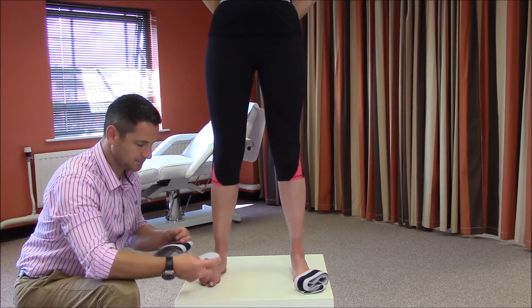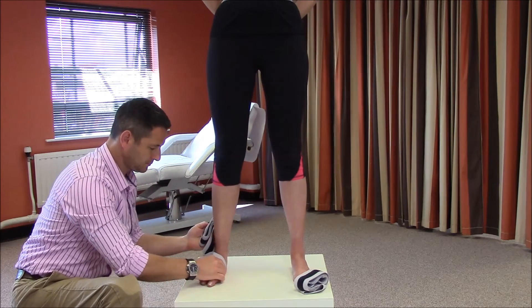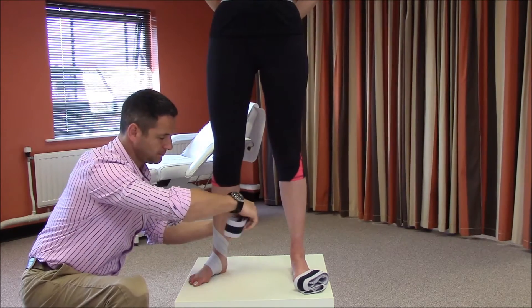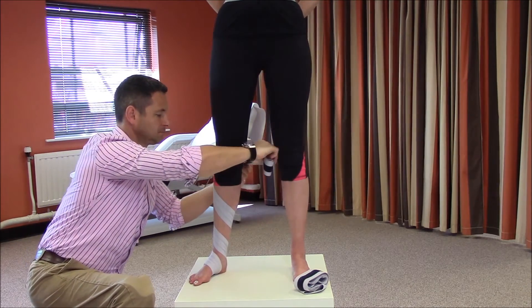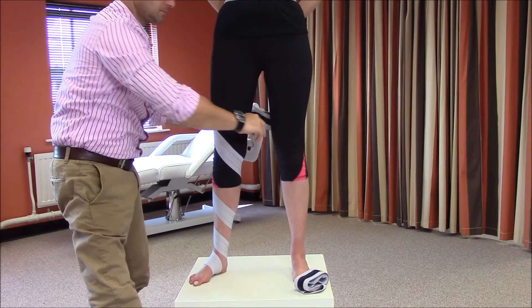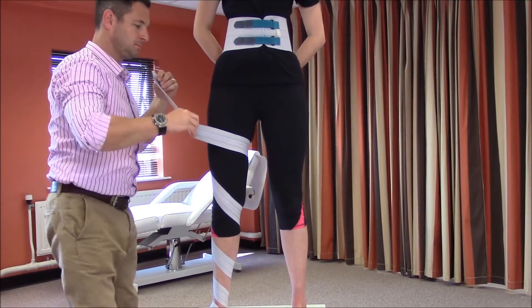Place the foot in the stirrup and wrap laterally over the instep and around the ankle. The garment should complete approximately four rotations of the lower leg and fasten to the contralateral side onto the abdominal binder.